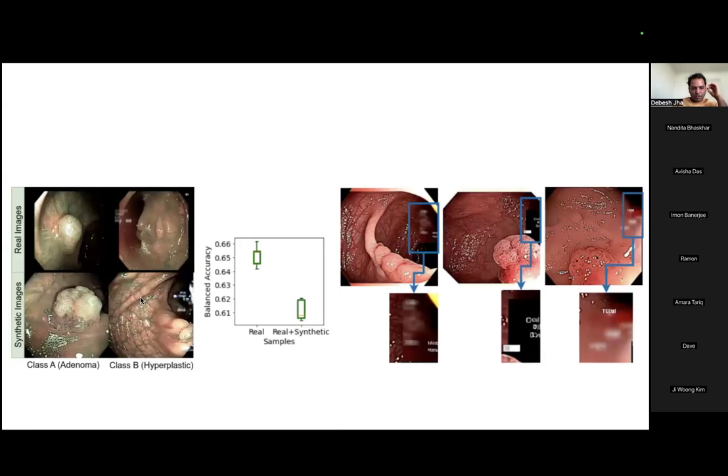And then, for example, we generated some images using a diffusion model. You can see some of the real images and synthetic images. Then we tried to compare the performance, running the model on real images and on synthetic images. You can see our model was better with real than with real plus synthetic, for example. When developing data using a diffusion model, for example stable diffusion, it also incorporates some of the real information, and sometimes it might degrade the model performance. So this is our learning from some of our studies.